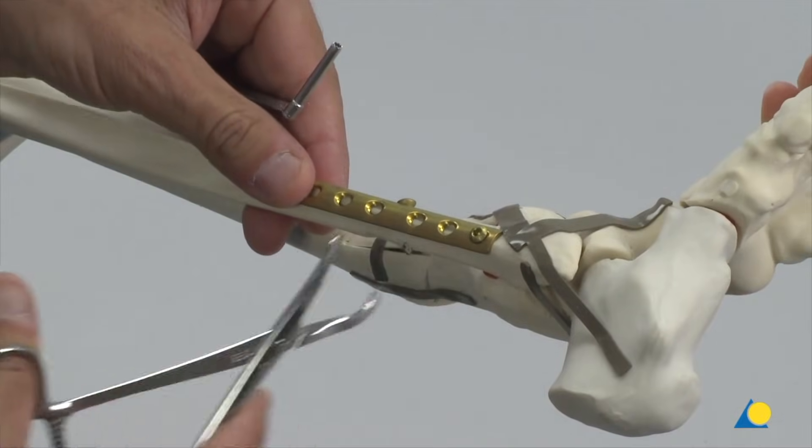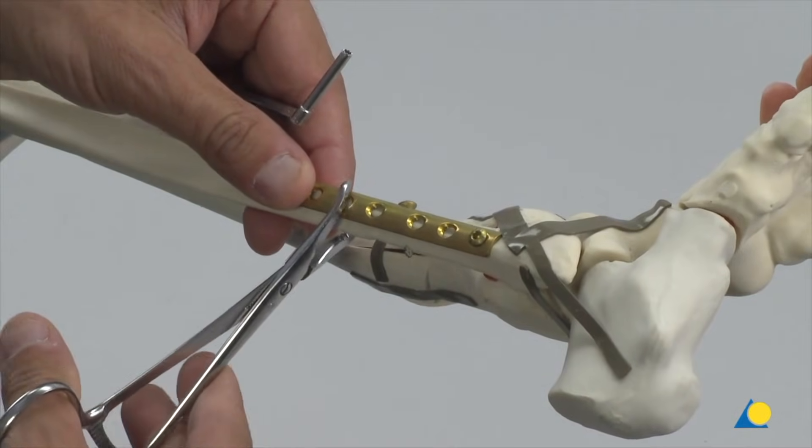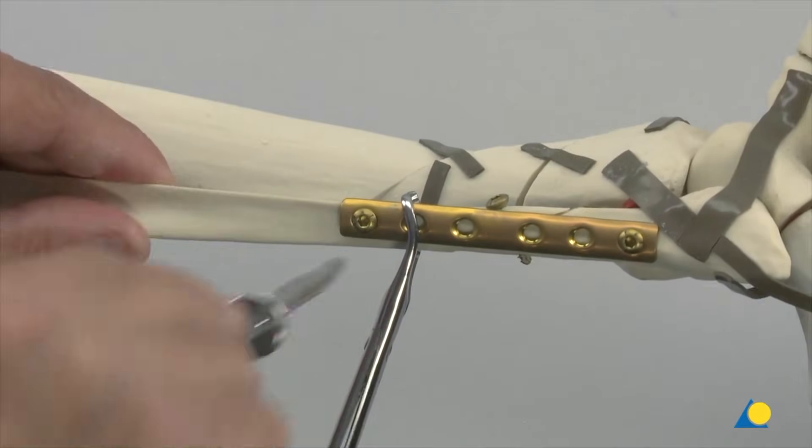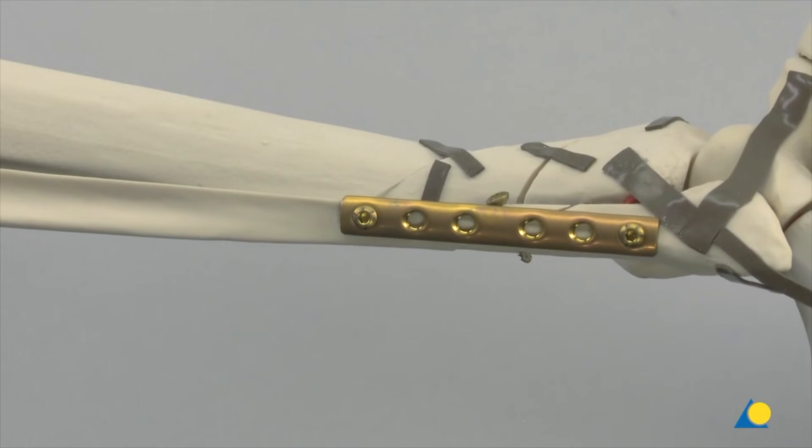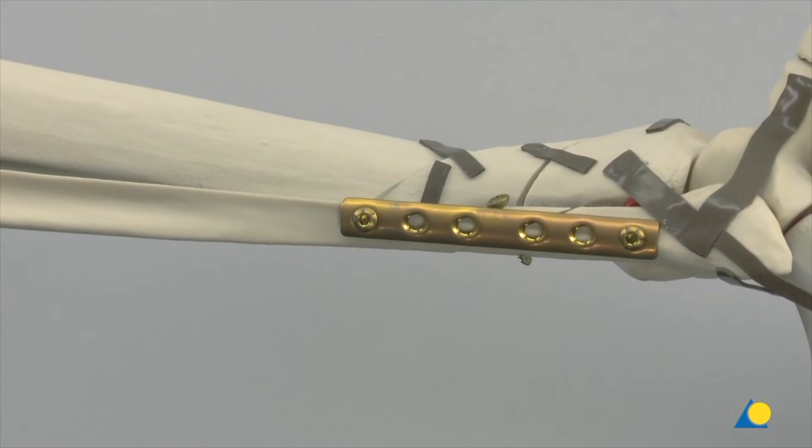The reduction forceps is repositioned to the proximal end and the drilling procedure is repeated. With the LCP one-third tubular plate fixed in position, the locking screws can now be introduced distally and proximally.